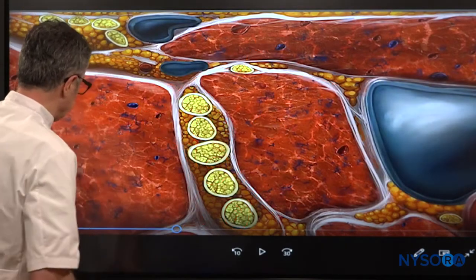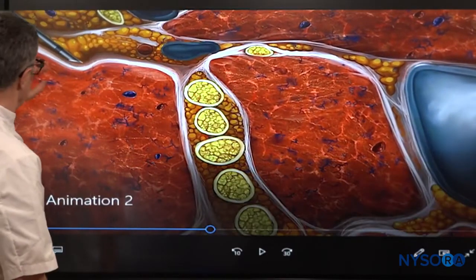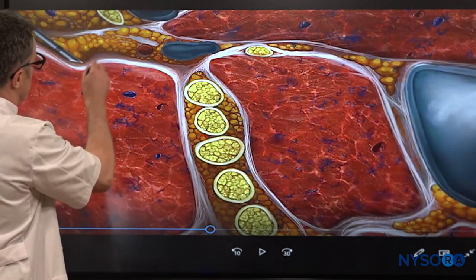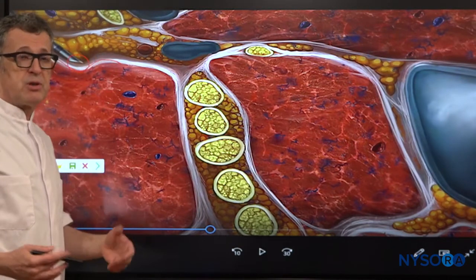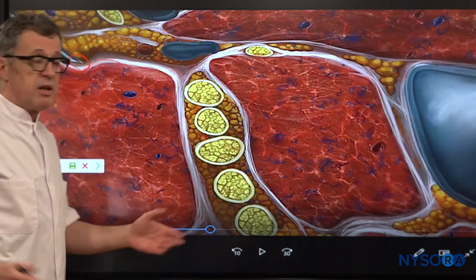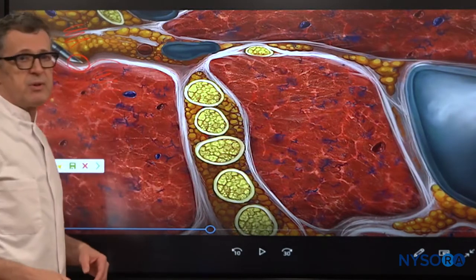Okay, so as we now watch the needle pass into the tissue, you can see how the needle now engages the cervical fascia. Fascia layers are tough. The needle always has to fight them. And as the needle pushes to penetrate the fascia, eventually the fascia gives in. The fascia is typically tougher than the tissue before the fascia or the tissue after the fascia.